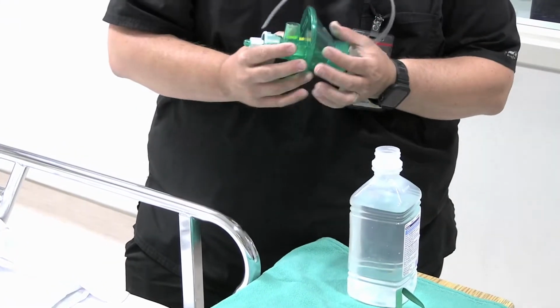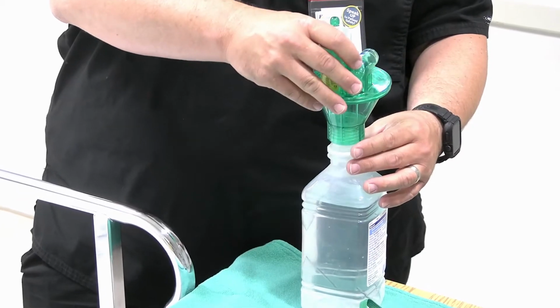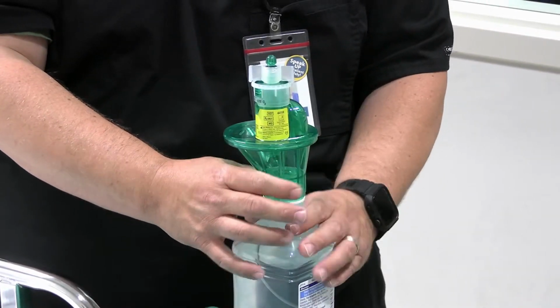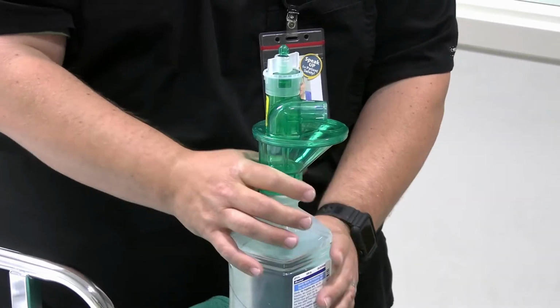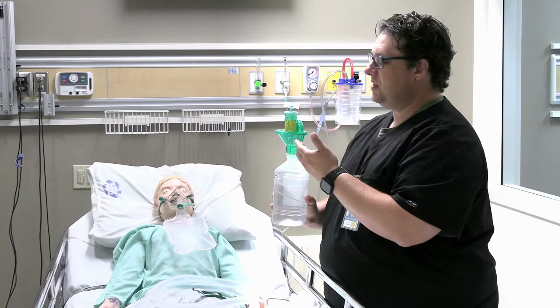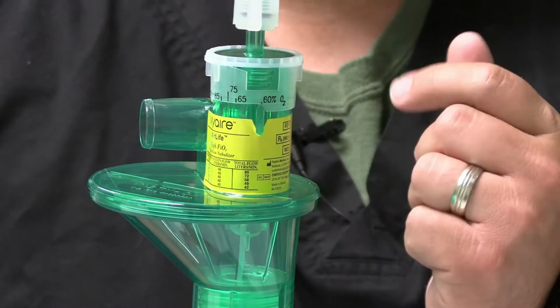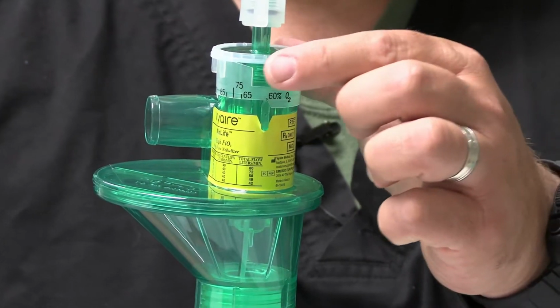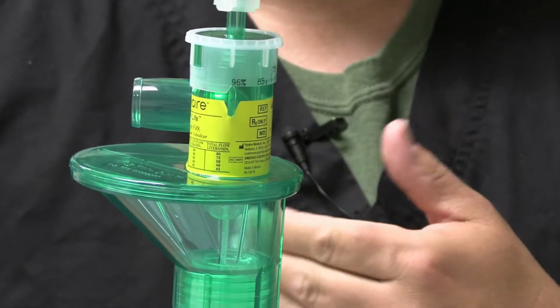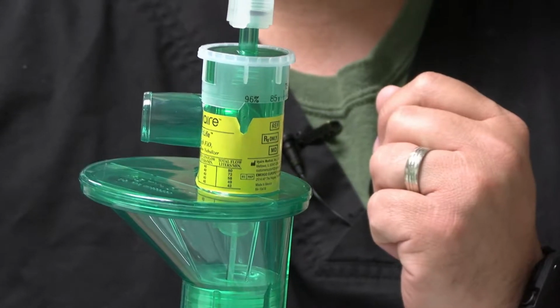Taking your HiOx hose, make sure when you insert it into the bottle, it gets all the way to the bottom, so that way all the water could be drawn up into the nebulizer. Just twist on your HiOx system here, and then that will be ready to go onto the wall. With the HiOx system, your graduations are on there labeled just like the other large volume nebulizer, but you will notice that you can only start at 60% FiO2, turning it up as high as 96% on the collar. So with our patient that we are going to be applying this to, they're on the non-rebreather, so I'm going to leave that at 96% here and demonstrate the setup.